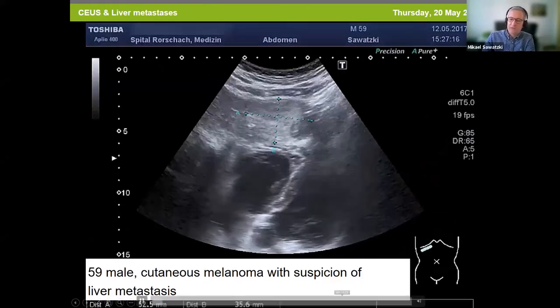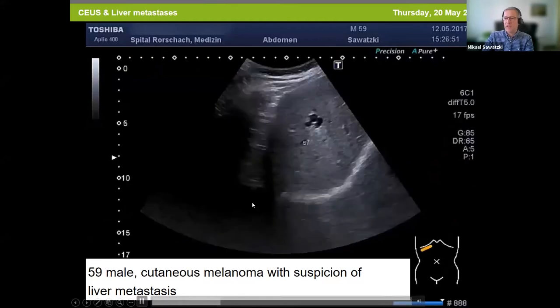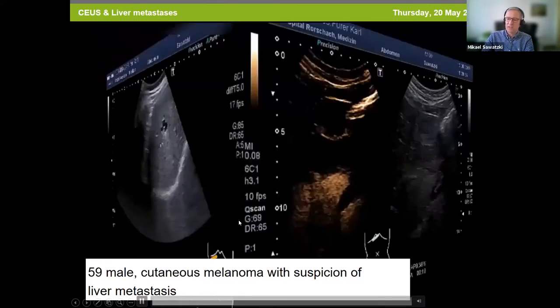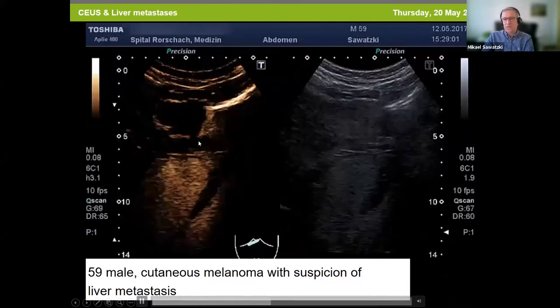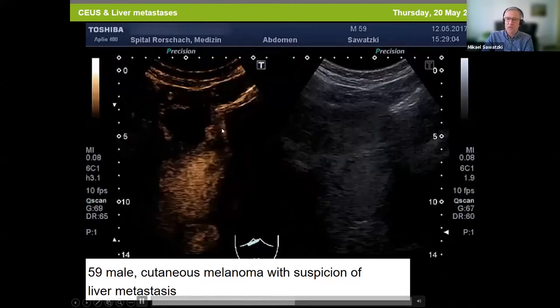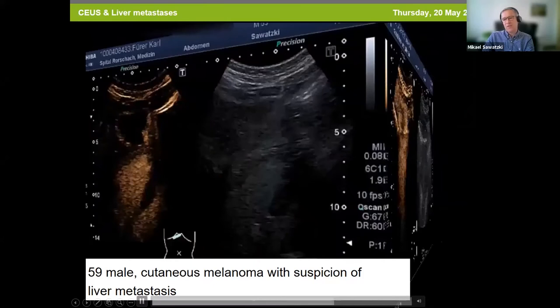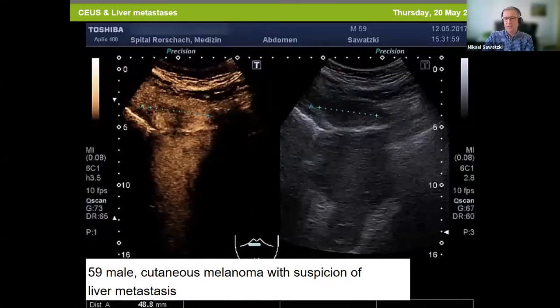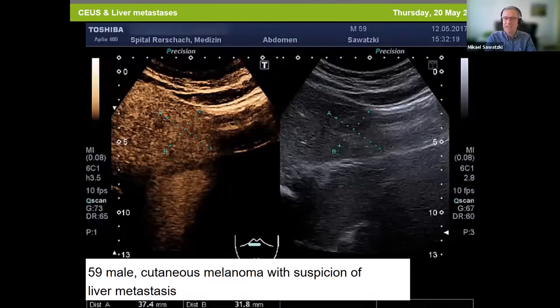In another case, a 59-year-old patient with cutaneous malignant melanoma with suspicion of a liver metastasis. A lesion in the left liver lobe, subcapsular, hypoechogenic, inhomogeneous. After SonoVue injection, you see rim enhancement first, then on later images a slowly centripetal filling — the whole lesion fills with contrast agent. There is no washout until 5 minutes, so after 5 minutes you can exclude liver metastasis. This is a hemangioma.